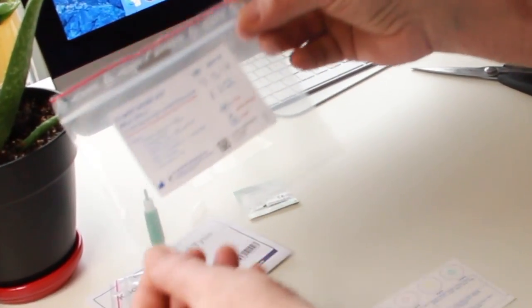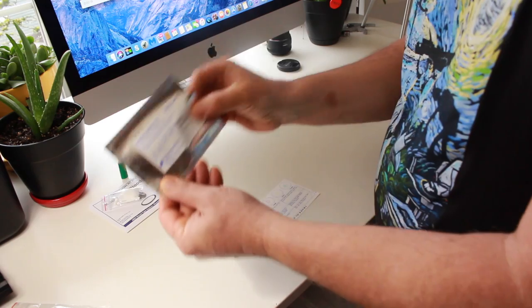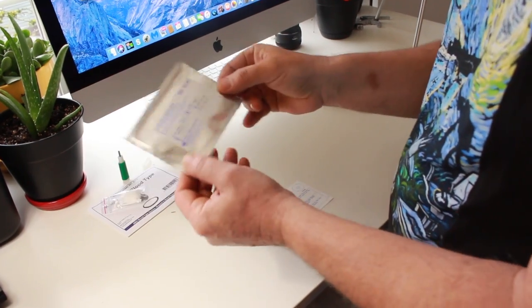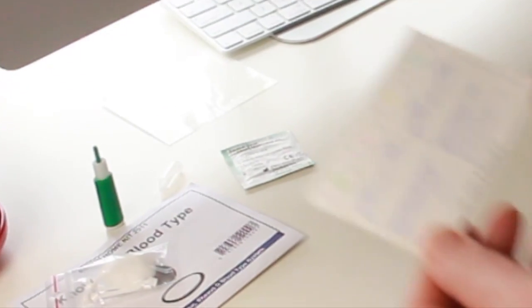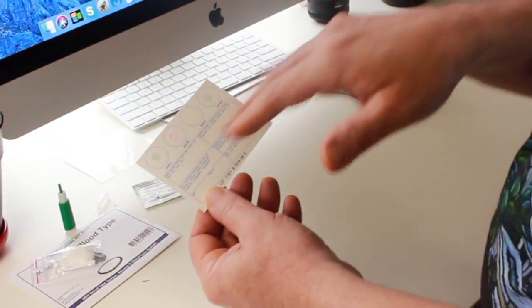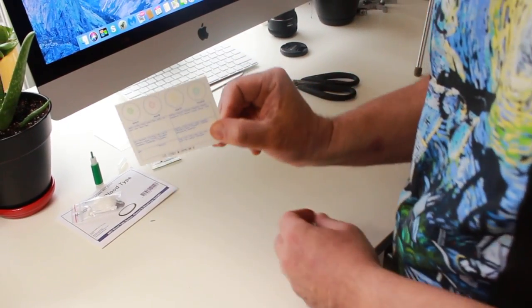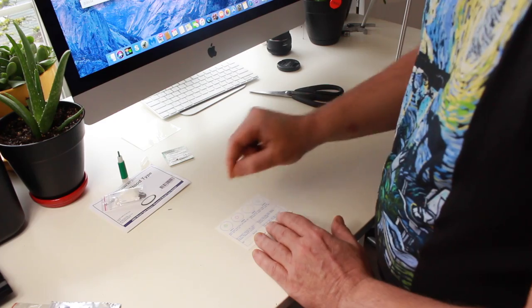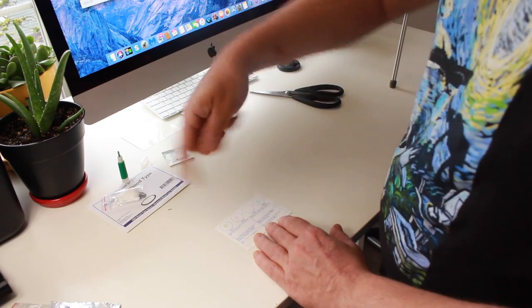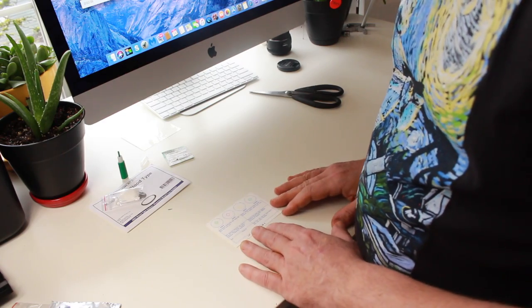Okay guys, I'm gonna show you what's in the Eldon Home Kit. It comes in this plastic bag. I've taken everything out already, and opened up the foil there. I got the card out. It's got four circles on there, each with a different reagent that will react differently to a different type of blood. I'm gonna put a drop of blood in each of these circles, mix it up, and the way it reacts, you'll be able to tell what your blood type is.